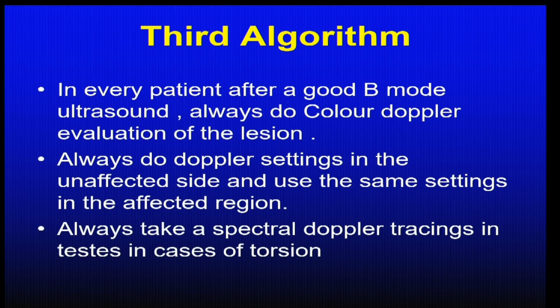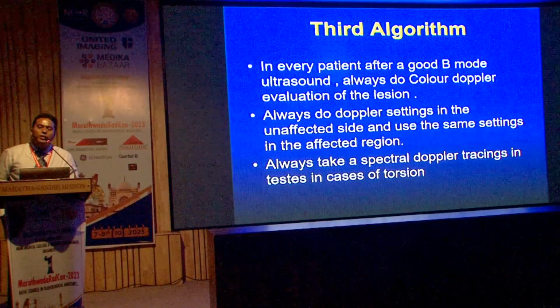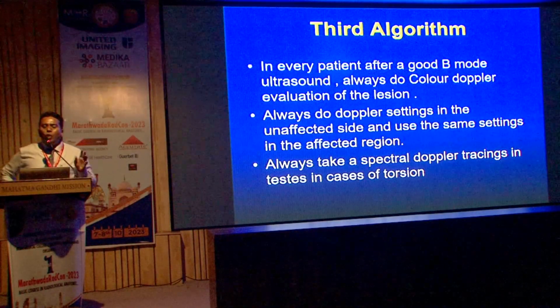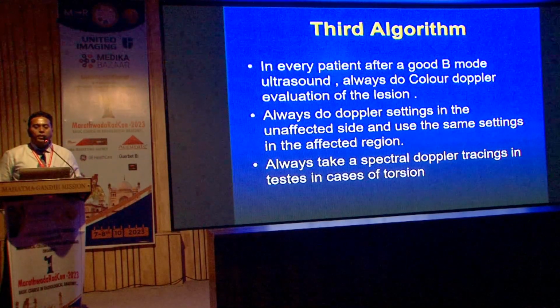Then in day-to-day practice, you do B mode. Yesterday also I was stressing upon you all that just don't limit your examinations to just B mode sonography. The clinician wants complete information. Always switch on to color and always do a color Doppler evaluation of the lesion.